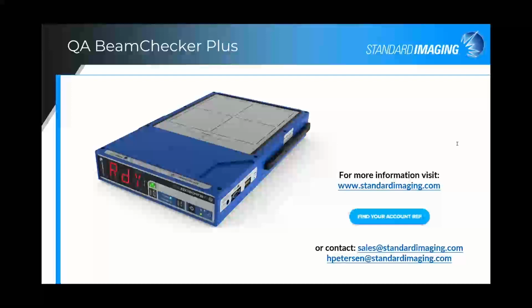How does it know what machine it is measuring? When you go in, you do have to select your room when you place it on the couch. It will know, because if you have room 1 6 MV and room 2 6 MV, they'll be different enough that if you go in your vault 1 and deliver a 6 MV beam, it will recognize that as that particular vault. So it will recognize the different beams accordingly per machine or per room.